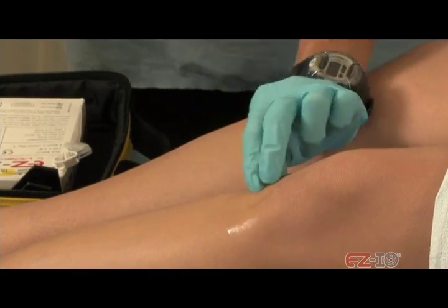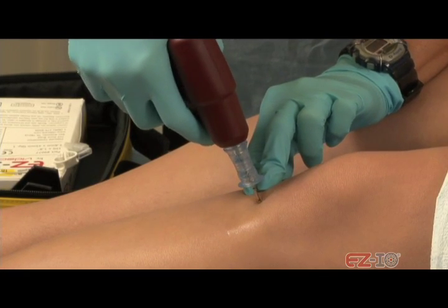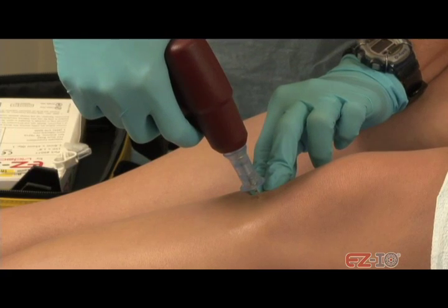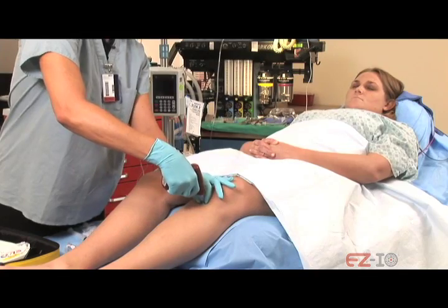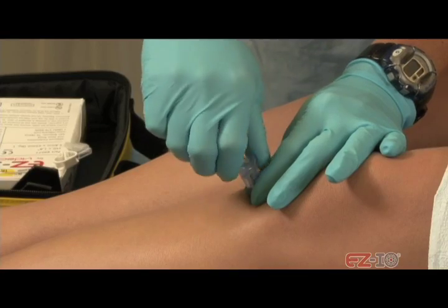Mm-hmm. Okay, quick poke. Ready? 1, 2, 3. Okay. How was that? That's all right. Doing okay? Mm-hmm.